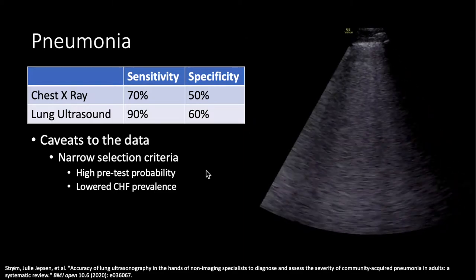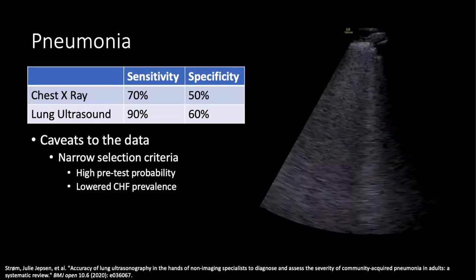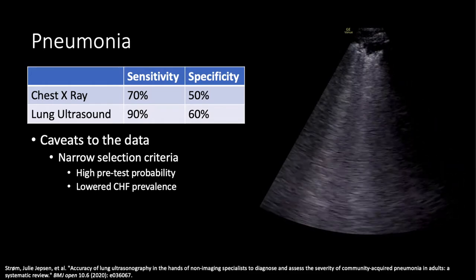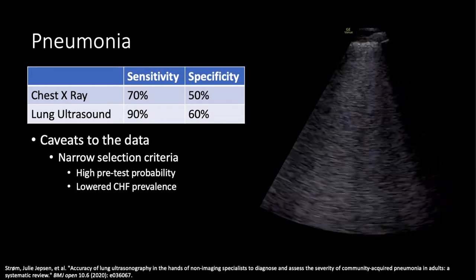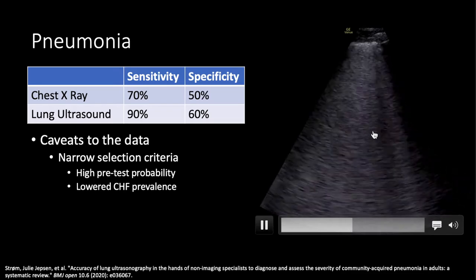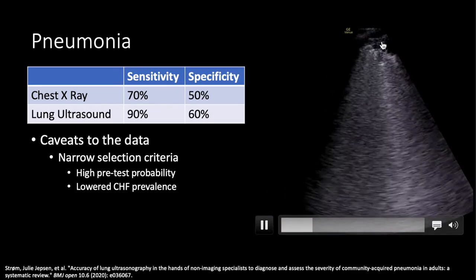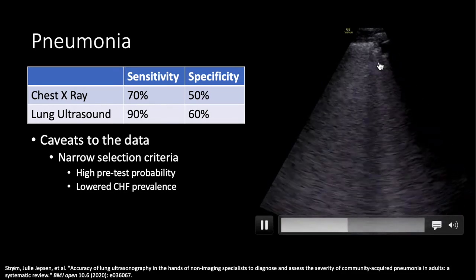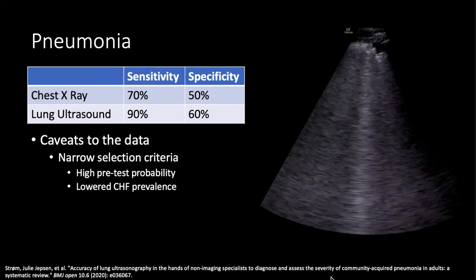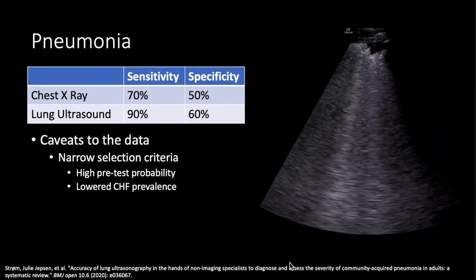Here is the ultrasound we placed on this patient. The chest x-ray wasn't obvious, but when you put the probe on the patient's left lower lung zone, you can see there are clearly several B-lines as well as what we'll call a subpleural consolidation. This is consistent with pneumonia and made the diagnosis in this case.